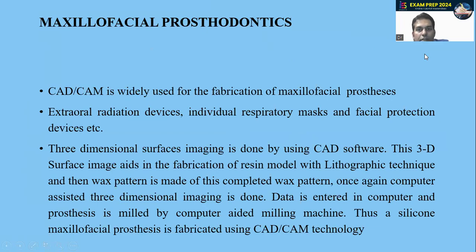Now, regarding maxillofacial prosthesis, CAD CAM is widely used for fabrication of maxillofacial prosthesis, extraoral radiation devices, individual respiratory masks, and facial protection devices, etc. The three-dimensional surface imaging is done by using CAD software. This 3D surface image aids in fabrication of a resin model with lithographic technique, and then the wax pattern is made with this completed wax pattern.